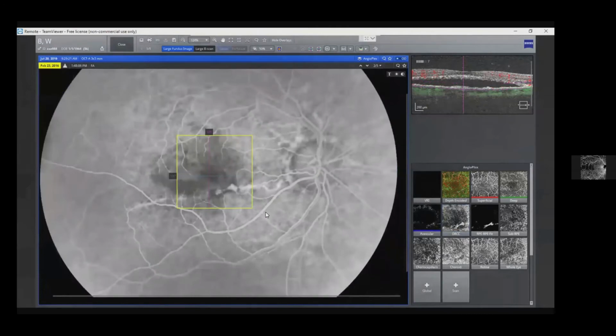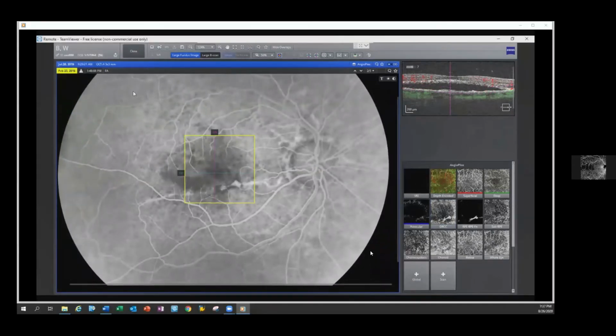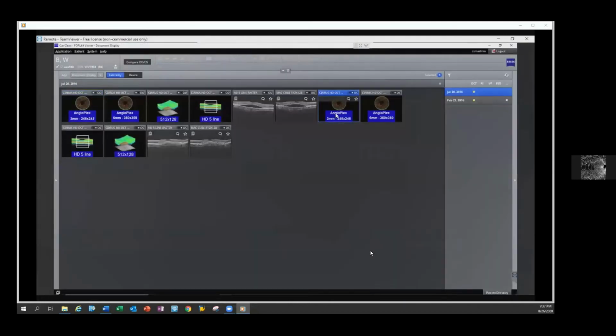So this patient actually ended up initiating anti-VEGF therapy in the right eye only, with improvement in their symptoms, and this hyporeflective cavity did get smaller, but didn't completely reduce to nothing because there was still this degenerating vitelliform portion. And you can actually compare it to the other eye.